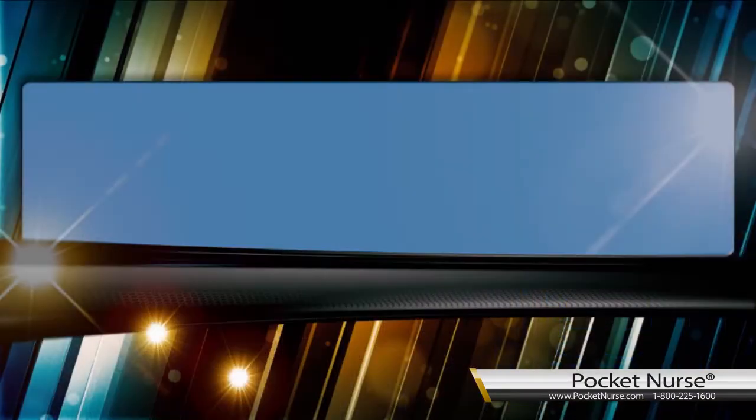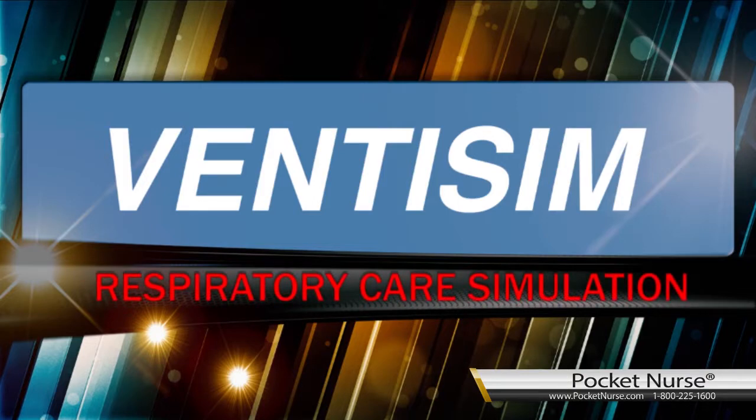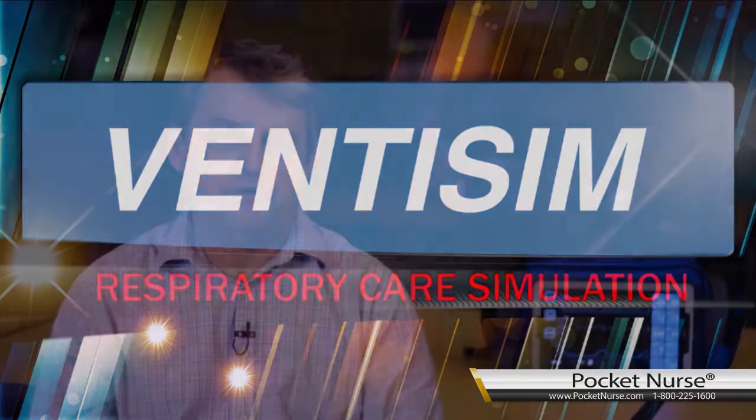The power of simulation is to put students in near real situations and develop their critical thinking skills. We wanted to take an opportunity to show you our new VentiSIM respiratory care simulator in a couple of real-life situations and provide ideas of how it can be used. It's a multi-purpose tool that can add simulation both in a lab setting or in a classroom setting. And that's what we wanted to show you today, the flexibility of the system.